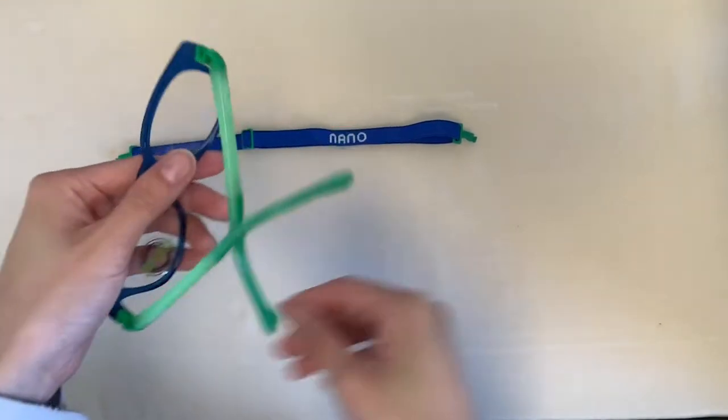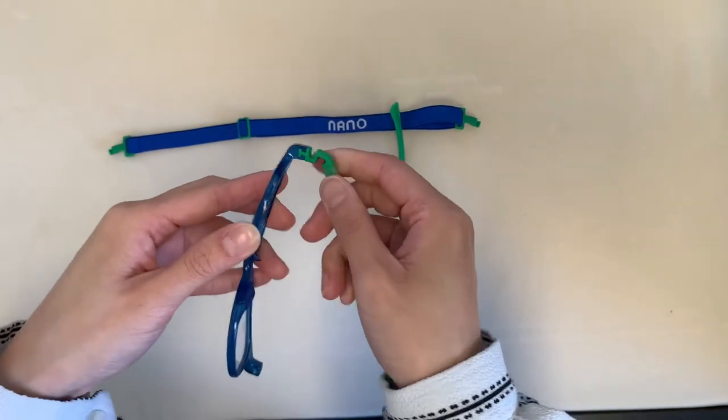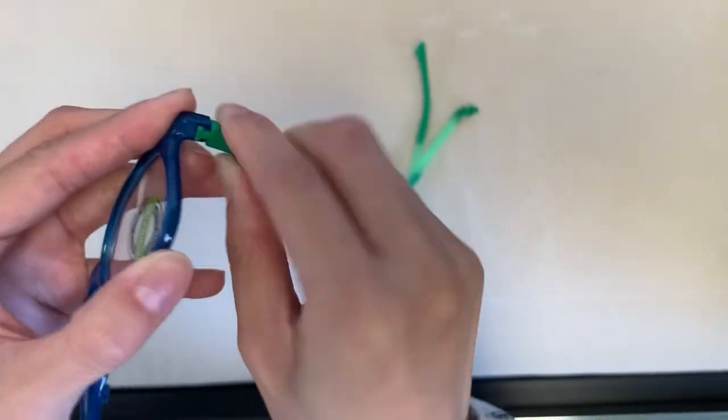The full strap can be used for any sports your child may play. To use a strap, simply push out the arms from the front of the frame. Insert the strap by aligning the T-shape and push them in.